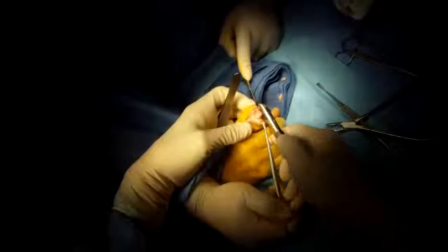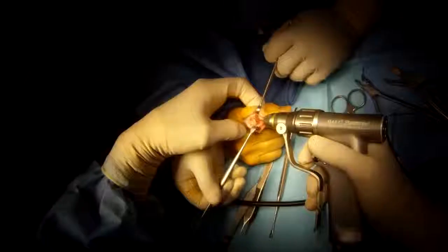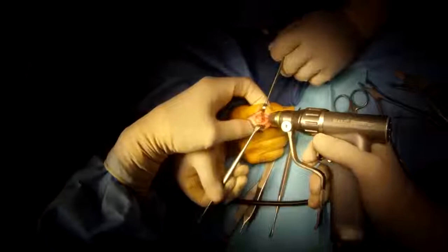Use a bone cutter to make nice flat cuts on either side so that they'll be well opposed to the desired angle of fusion. Smooth it out, and place a guide wire through the bone on the left.